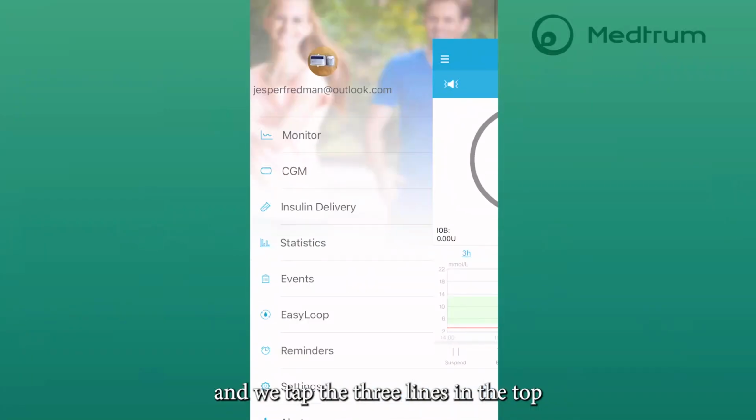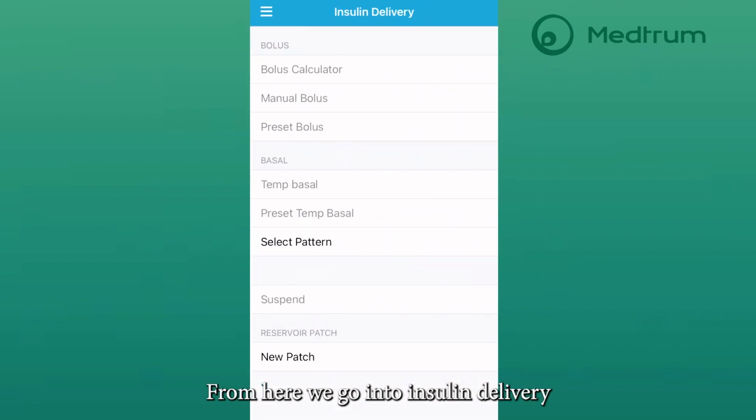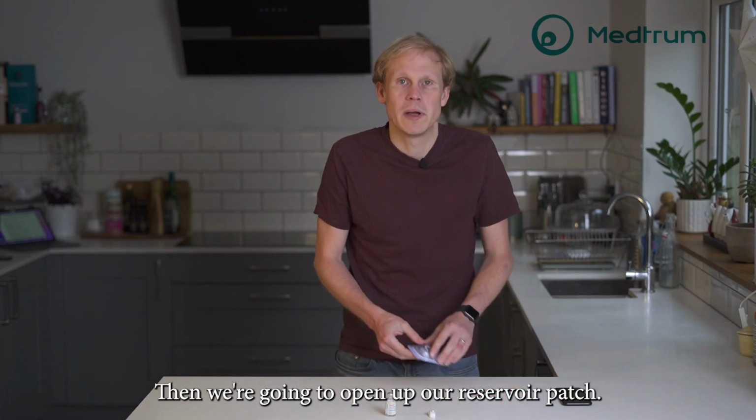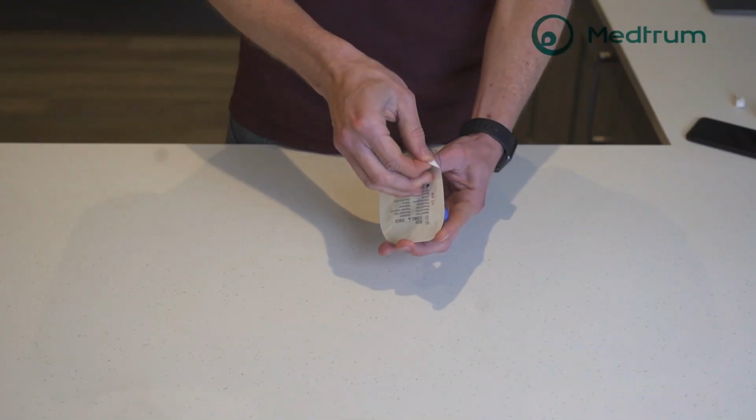and we tap the three lines in the top left to access our main menu. From here we go into insulin delivery, and then we select new patch. Then we're going to open up our reservoir patch.